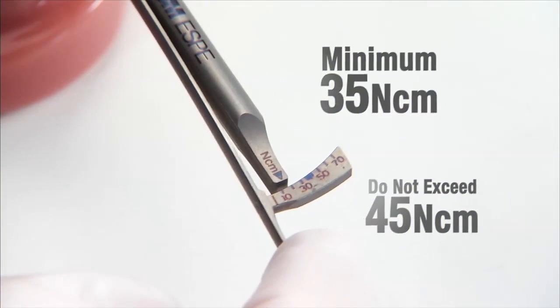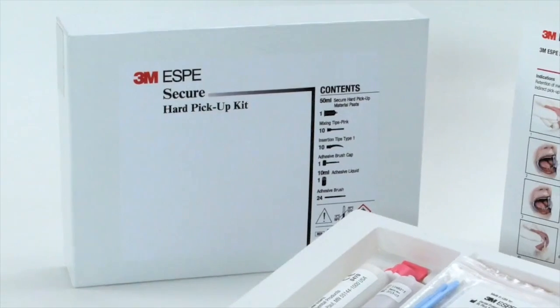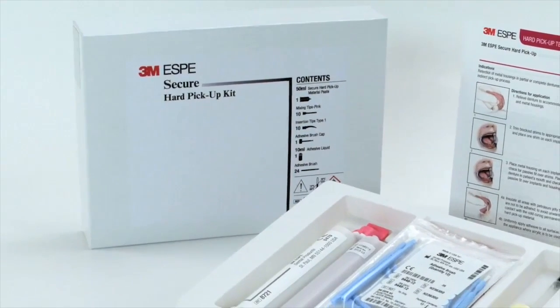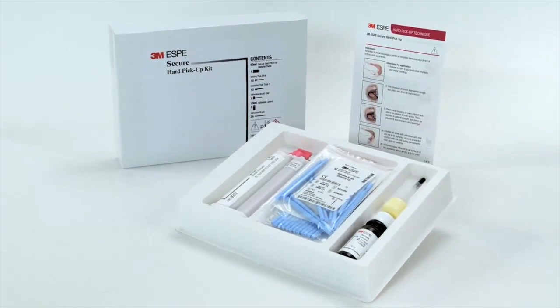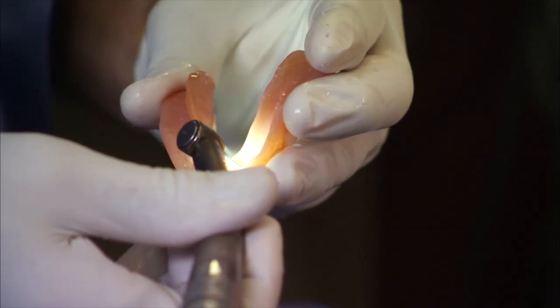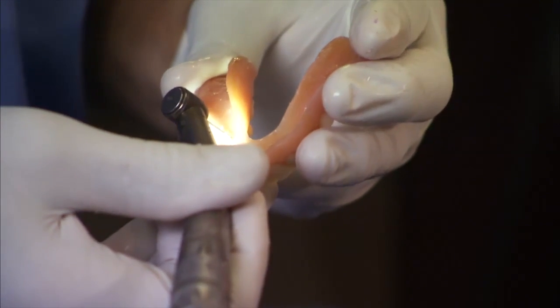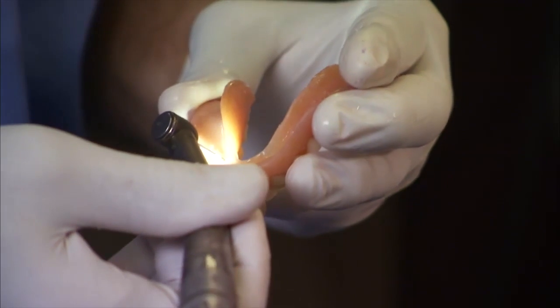In most cases, you can achieve 35 newton-centimeters of insertion torque and the denture can be immediately adapted to the implant abutments in a hard pickup procedure with the 3M Secure Hard Pickup Kit. First, determine the location for the metal housings to each implant in the denture and create a hole or trough to accommodate the housings in the denture.